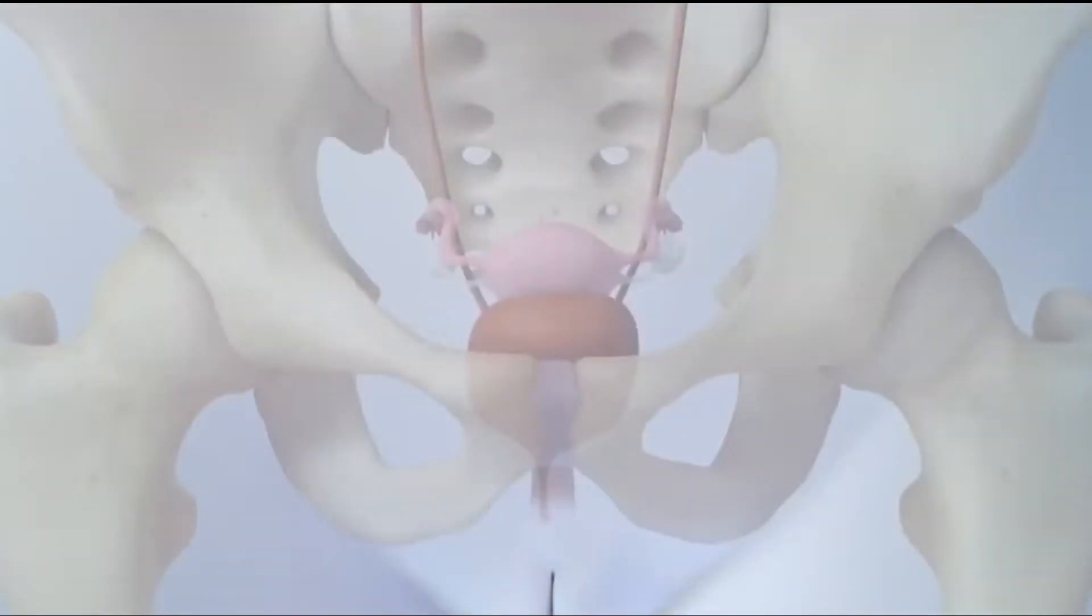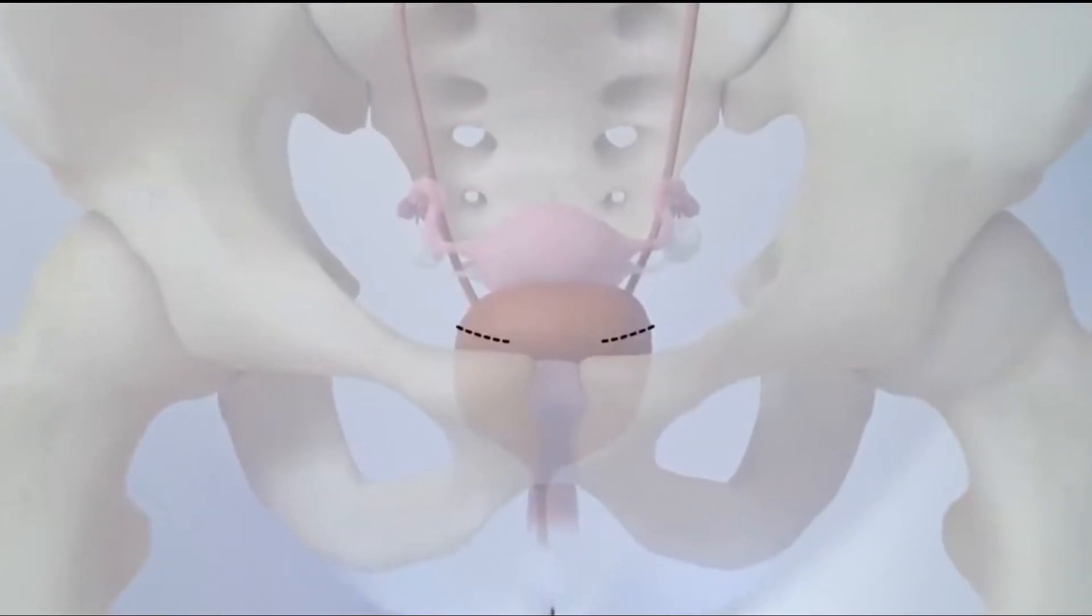To start the procedure, the surgeon will make two small incisions in your abdomen just above your pubic bone. Another small incision will be made in your vagina.